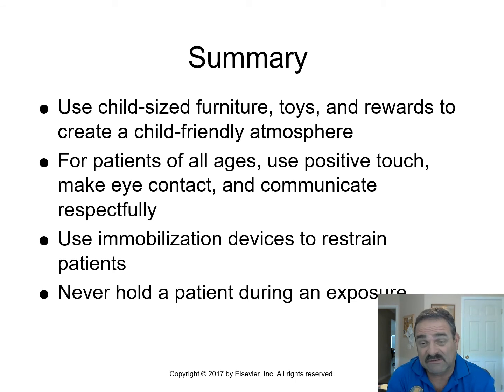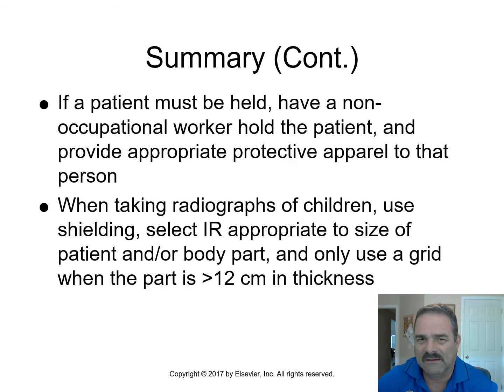Use immobilization devices to restrain. Good luck. Never hold the patient during exposure. Somebody else is going to have to do it. Make sure to protect them. All right, so if a patient must be held, have a non-occupational worker hold the patient and provide appropriate protective apparel.